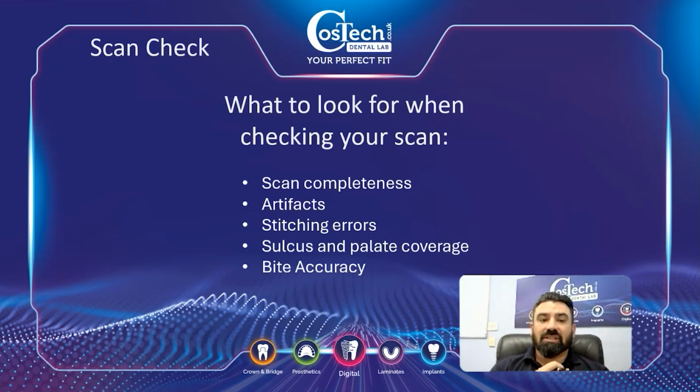The bite accuracy, again, like I was saying before, making sure you scan the entire bite. Sometimes the patient, if they've been lying back in the chair, actually records an improper bite. A lot of systems, you can actually scan just the bite. So when the patient first walks in and you know you're scanning for a denture, while they're still standing, just get them sitting up in a chair and scan the bite. You don't even have to attach it to the final job that you're going to be scanning.